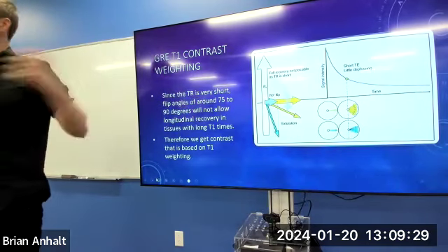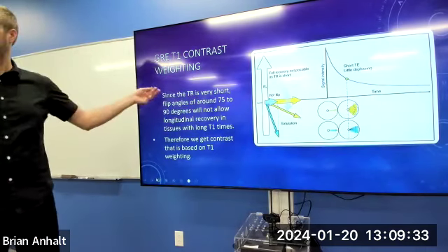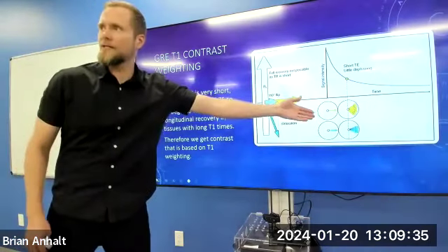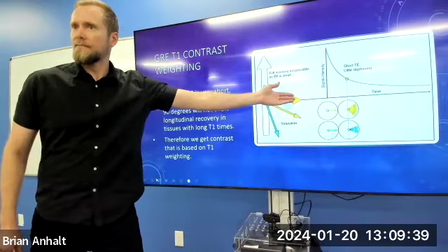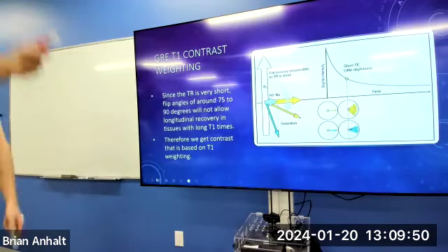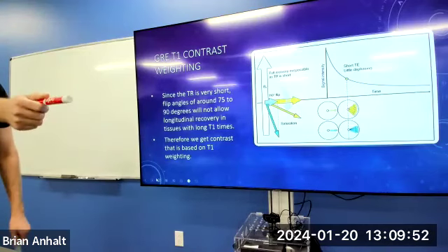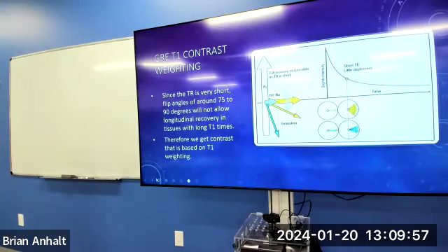Yeah, in this, it's eliminating dephasing, right? And since we're not eliminating T2 star in a gradient echo sequence, we're eliminating the T2 star information that we're seeing here with that short TE. That high flip angle is going to allow for us to saturate tissues that didn't recover back quickly. Tissues that recover back quickly, fat, will show up bright still.